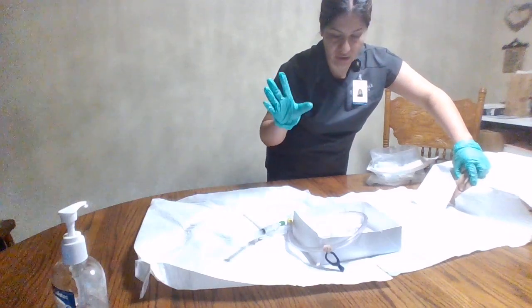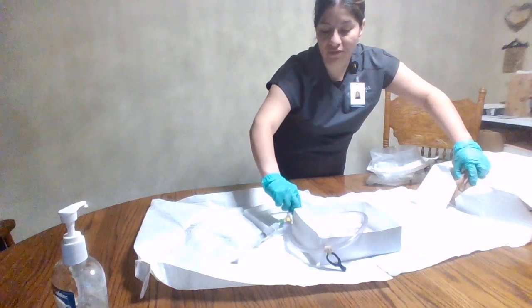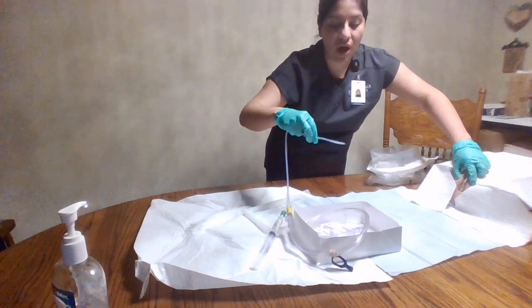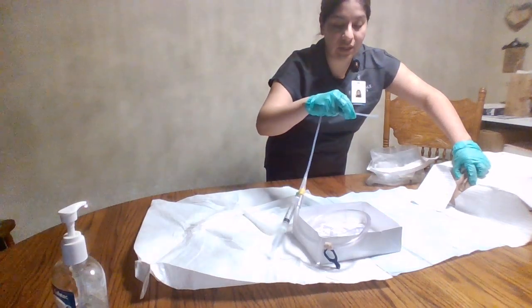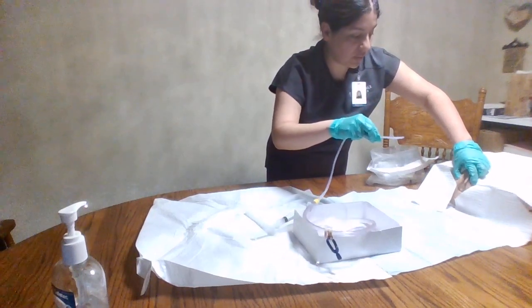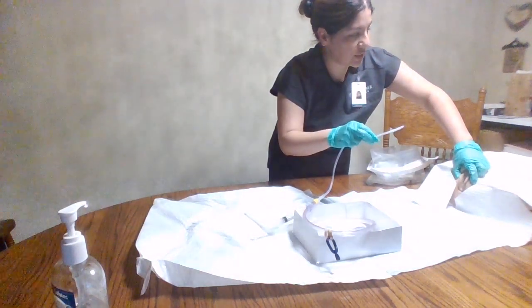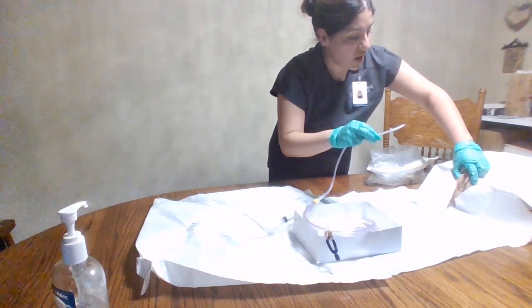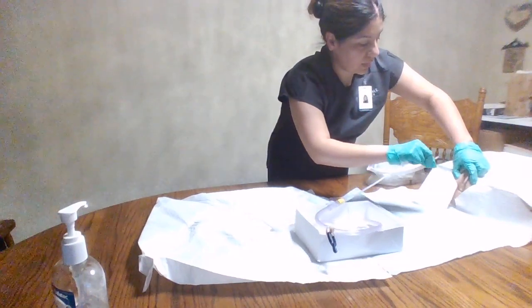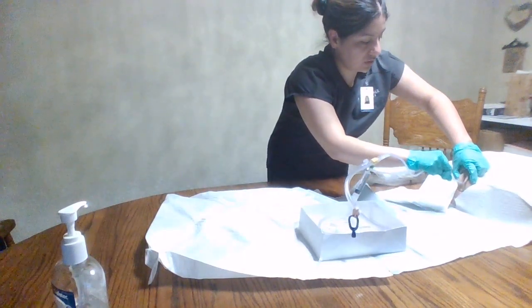All right. And without letting go, I will go ahead and grab the catheter. I will make sure to grab 5 to 7.5 centimeters, which is about 2 to 3 inches away from the lubricated tip. And I will go ahead and place it through. So Mrs. Smith, I am ready to insert the catheter. If you could go ahead and take a deep breath from me, and then on the exhale, I will insert the catheter. Okay, so if you want to take that deep breath. Okay, we'll go ahead and insert.